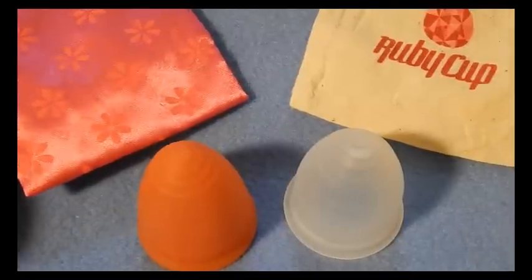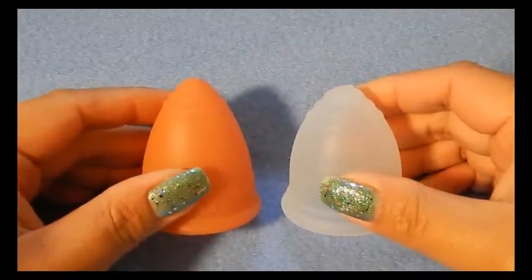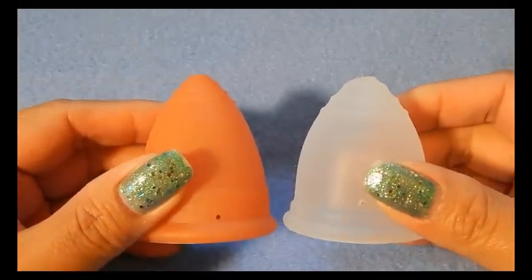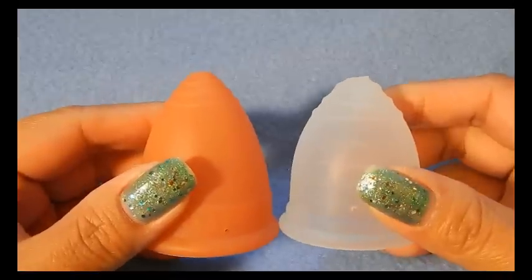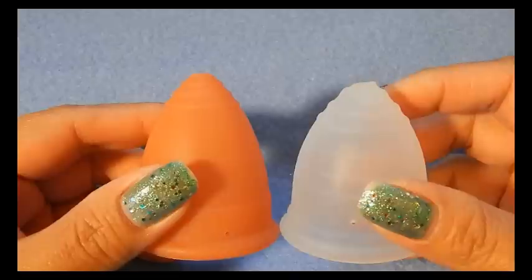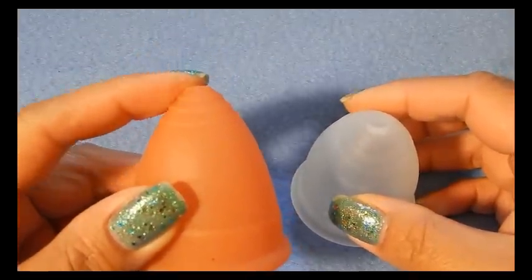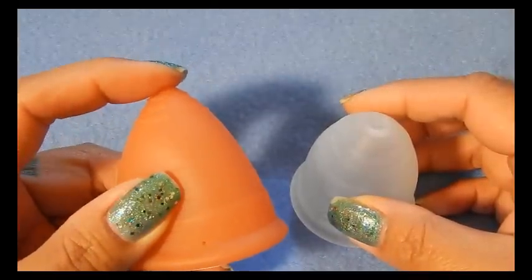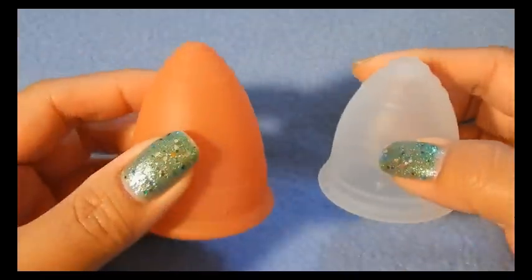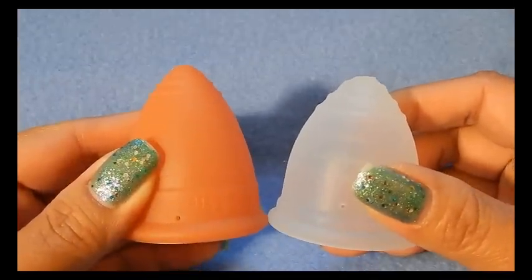I'm going to pull these pouches away so I can focus on the cups themselves. Starting with the stems — or the lack of stems — as you can see both of these cups don't have their stems anymore. I purchased my Ruby cup in a de-stash and they had taken the stem off all the way before I received it, and I just recently took the stem off my Lunette all the way as well. I will leave a picture here of both cups with their stems intact.